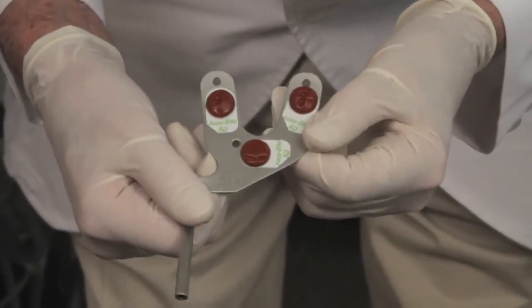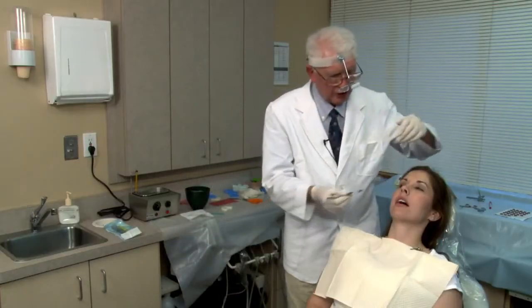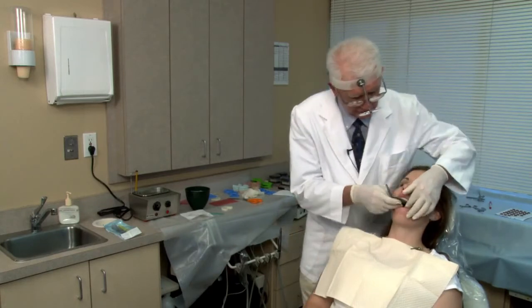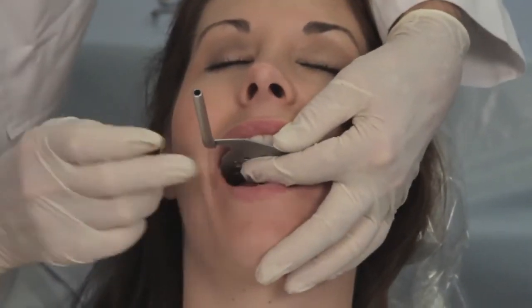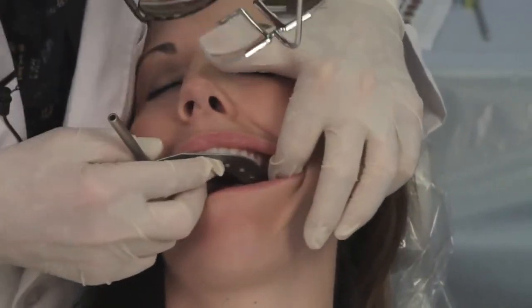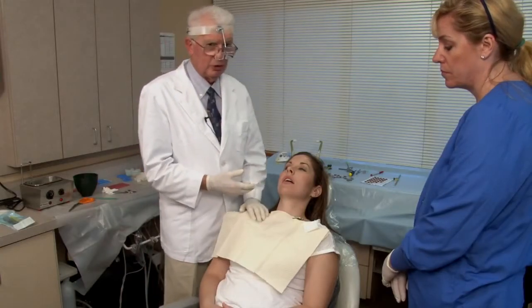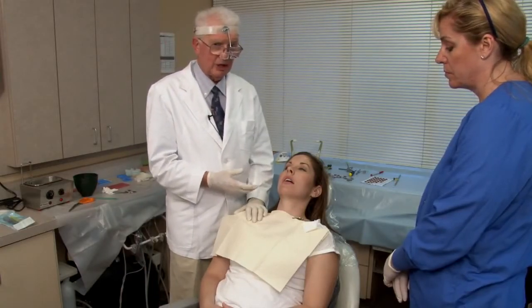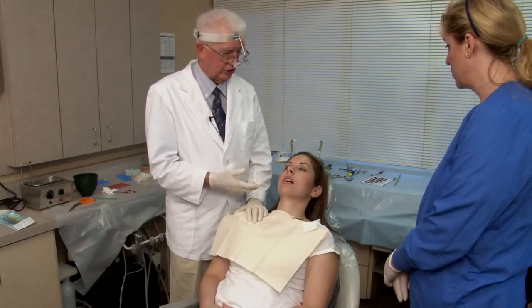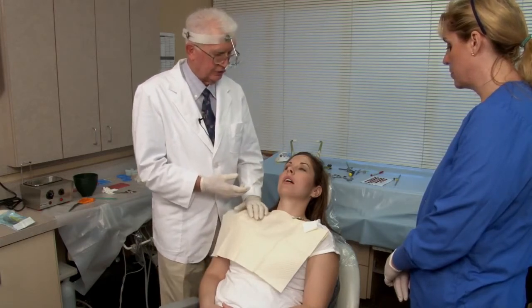This is pretty good cusp tip indexing. I will put it in the mouth again and look. I want to look and make sure that the teeth are not touching the bite fork anywhere, and that it fits stable. And I'm going to use Beauty Pink Extra Hard Wax on the bottom of the bite fork and have the patient close into it, and she will stay closed on it then, holding it against the upper teeth.